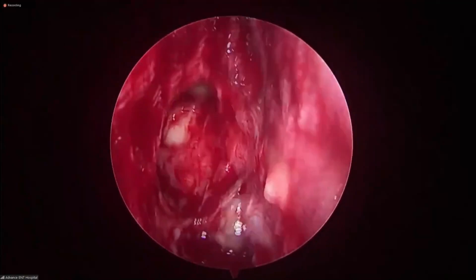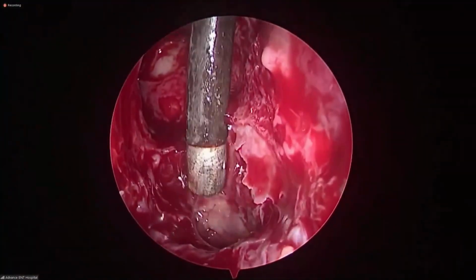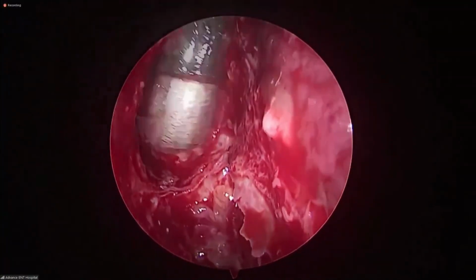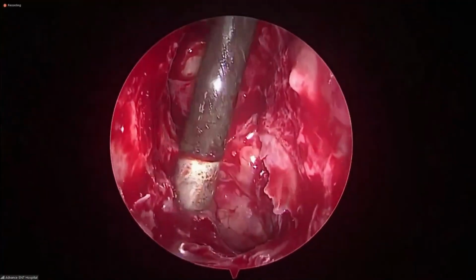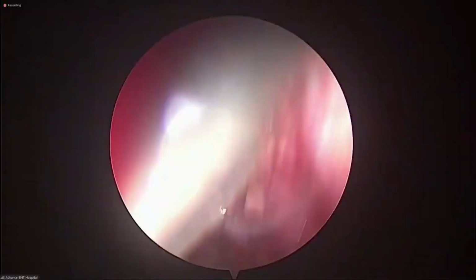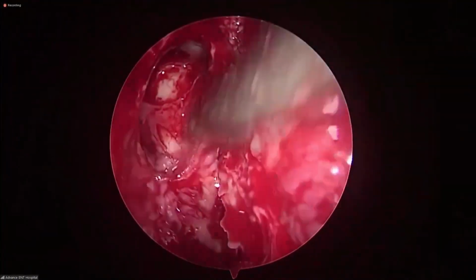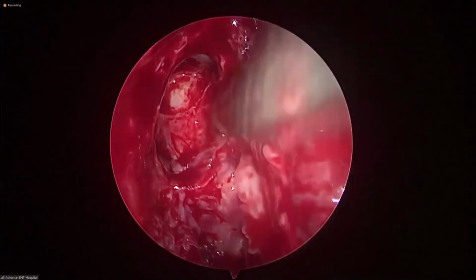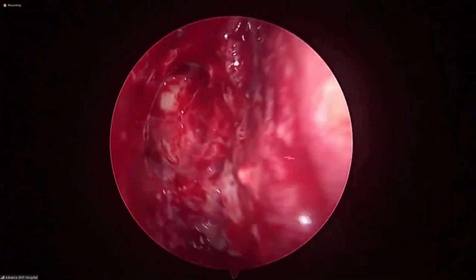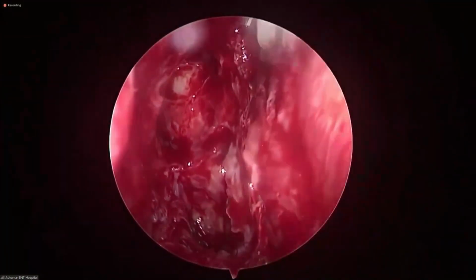See this. Flush with the skull base. Yes. See the posterior sphenoidal skull base, anterior sphenoidal skull base. This is very safe. This gives you full access to the frontal sinus for drugs to reach there. See this? Yes, sir. See the frontal, how big it is now. Yes, sir. In such a difficult situation.